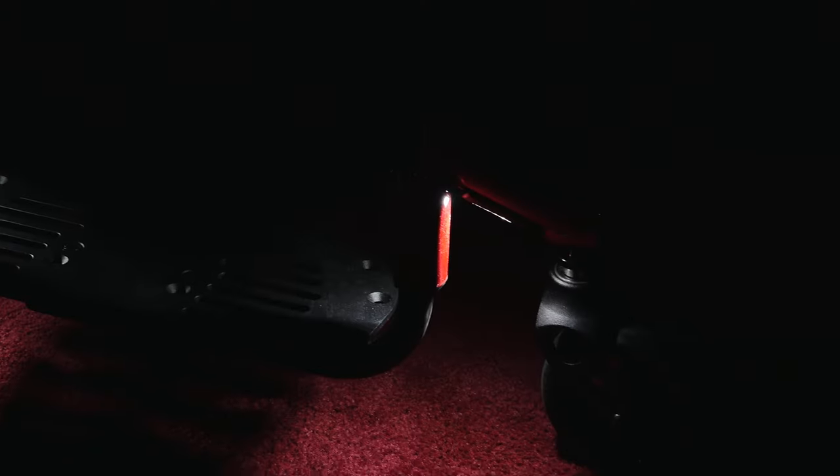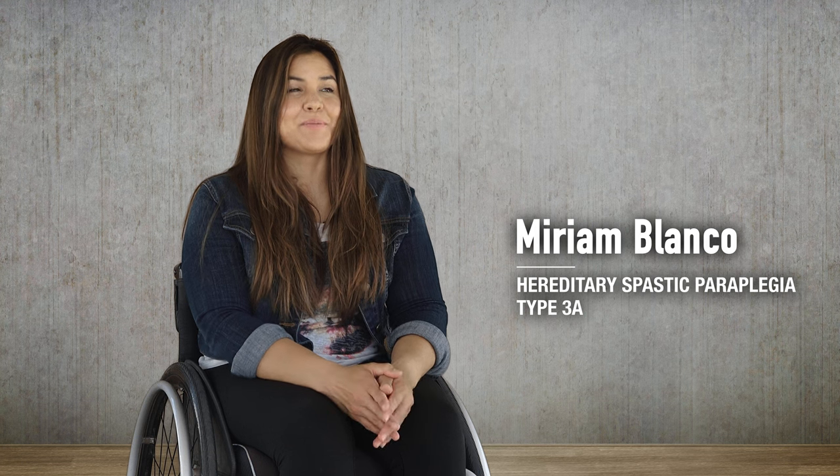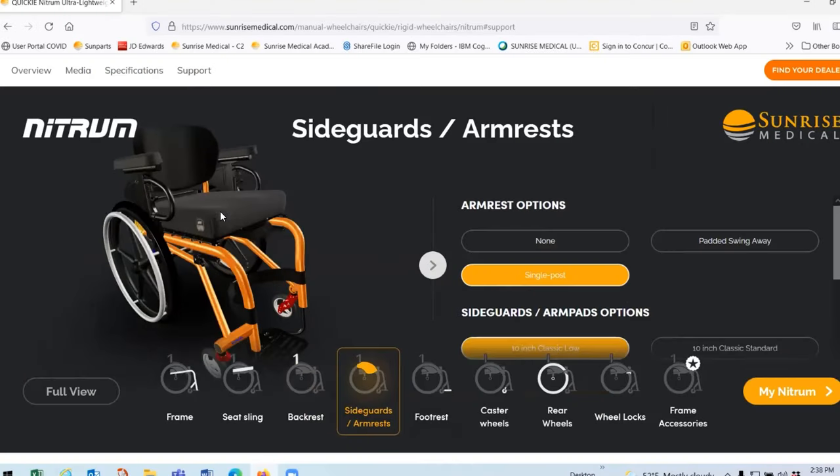The Quickie Nitrum has a really cool feature: a headlight, so you'll never be in the dark. I tried the red Nitrum and I really liked it — it was easy to use and really lightweight, easier than the chair I have now. If you want to see a website that's off the charts, go look at Sunrise Medical. Their Nitrum chair has a 3D visualizer where you can add your colors and features so you know what you're going to get before you get it.